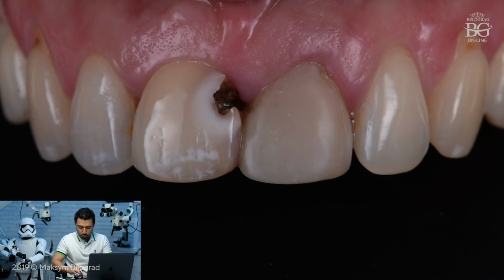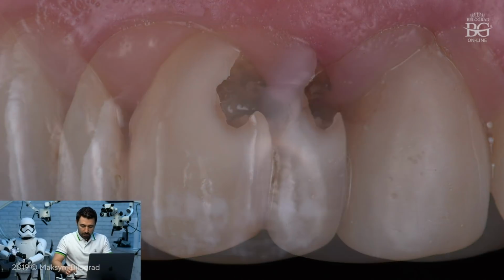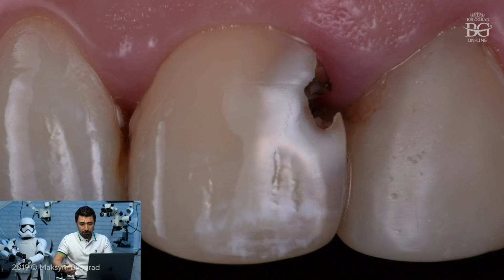Let us go to a more close-up picture so you'll be able to see a really big caries defect. When we were evaluating these pictures, we named it a big caries hole, a huge one. You see the caries itself, and if you imagine this demineralized enamel, the real defect is pretty huge. Okay, the lateral view of the central incisor. Here you can also see a caries defect from the distal area and also some caries defect on the lateral incisor as well.